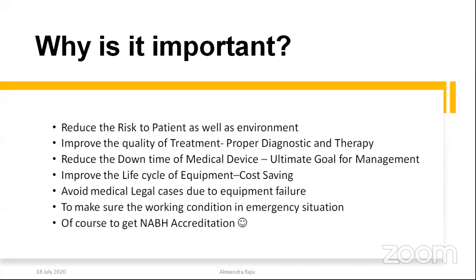Reducing the downtime of the medical devices is the ultimate goal of management. We have to ensure that when we are calibrating, if the accuracy or the precision is not met, we can see there is some fault within the equipment or the accessories have to be replaced. There are several things that can be identified from the calibration report.